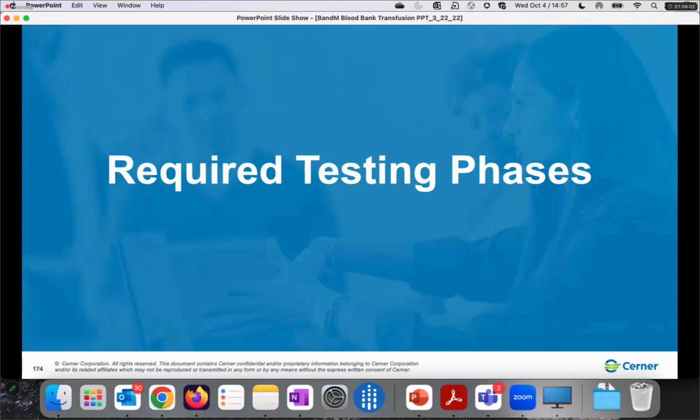Most commonly what you'll see used in blood bank is these different phase tests will have an immediate spin phase where we just stick the sample in a centrifuge, spin it out, then test it. There's another phase where we put it into a 37-degree water bath to simulate human body temperature. Another phase where we'll add the anti-human globulin as an additional reagent.